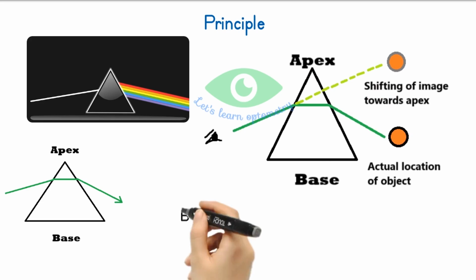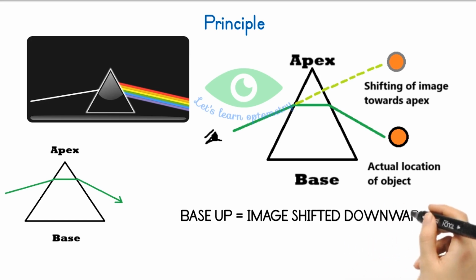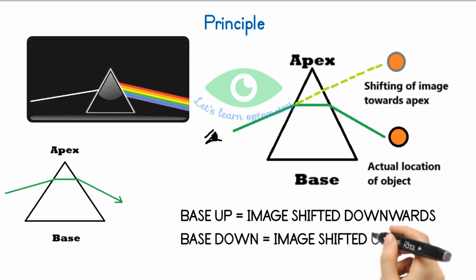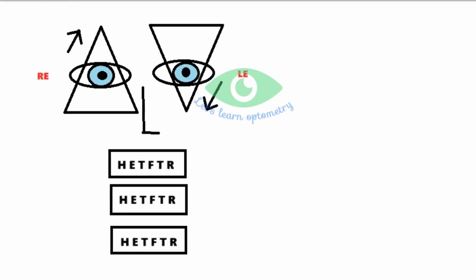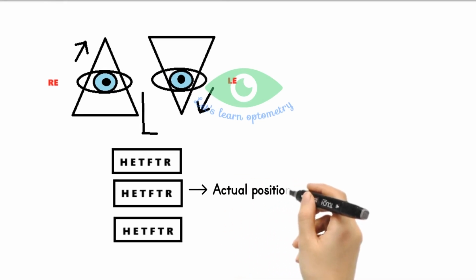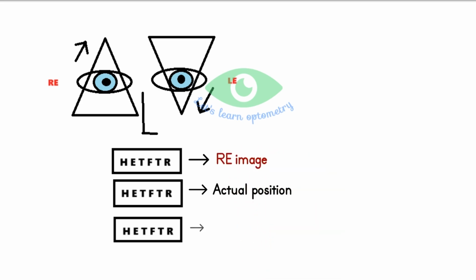When we place a prism base up before one eye, the image will be shifted downwards. And when we place a prism base down before one eye, the image will be shifted upwards. This is the basic principle of this procedure. We place prisms before both eyes with their bases opposite to each other. So we get two images, one in the top and the other in the bottom. So the patient can see two images at the same time.